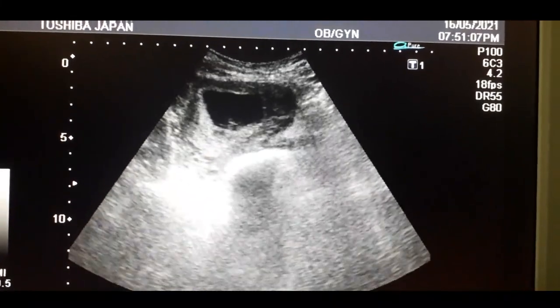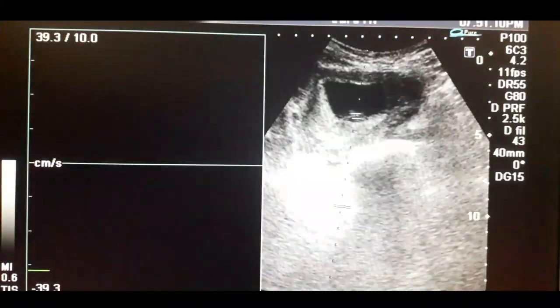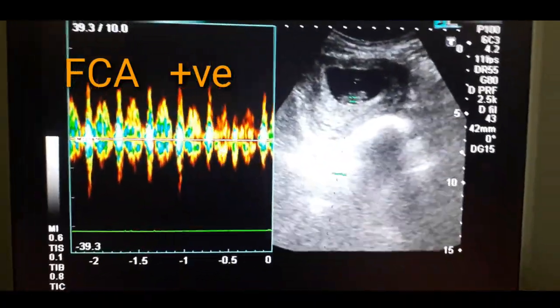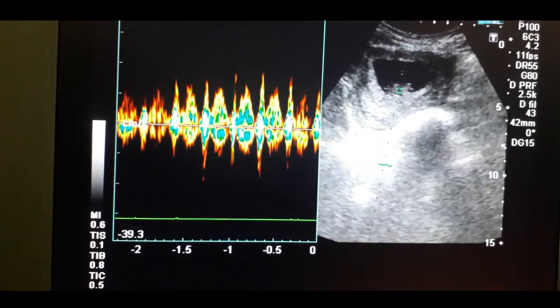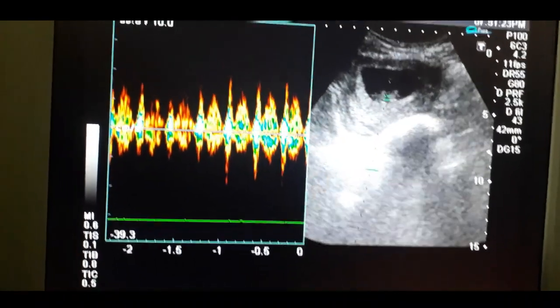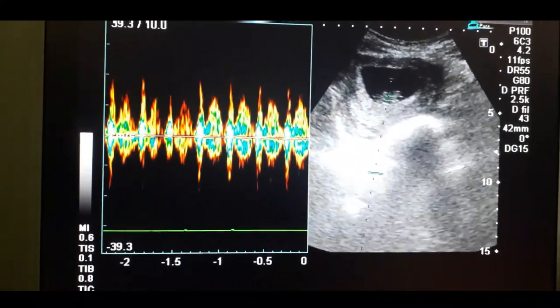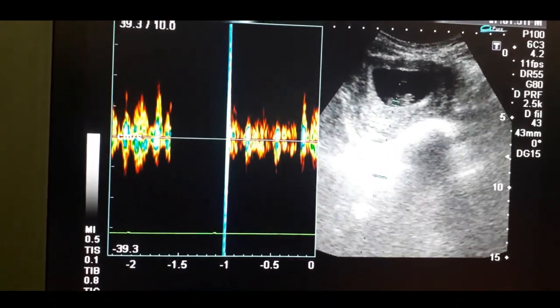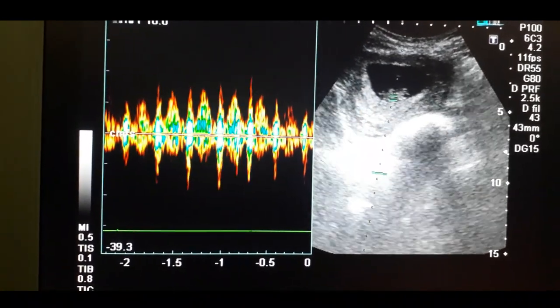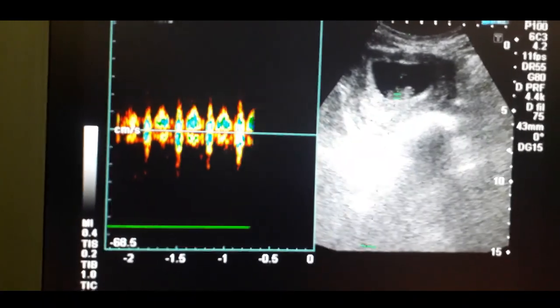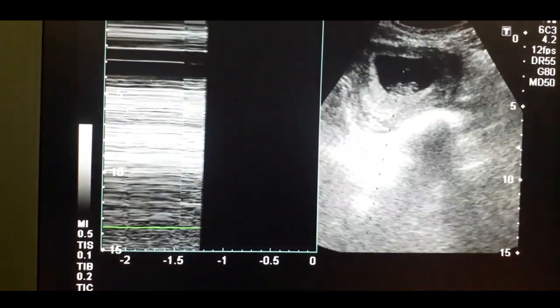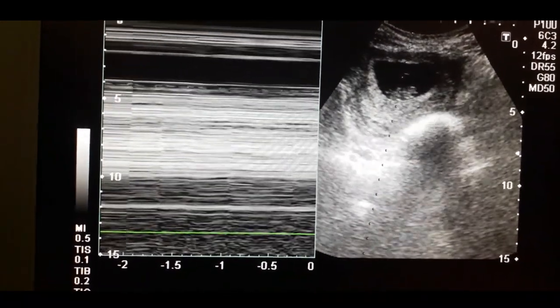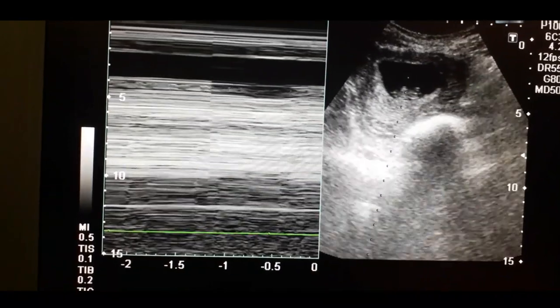You can see there is very decreased motility of the fetal pole, but there is audible cardiac sound present within that fetal pole. This cardiac activity is audible, so FCA is positive, and that shows the alive fetus. This also shows that there is the formation of cardiac tissue within the fetal pole.